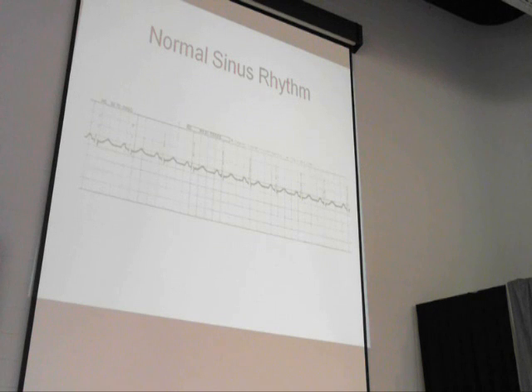Okay. And on the back of your first page, we have every rhythm that we look at, either normal or abnormal when we get into ACLS. We have to give it a name. We have to give it a label. And when we're standing at the desk looking at the cardiac monitor, or standing beside the patient's bed in the unit, or looking at a printout of the practitioner's ordered EKG, we're looking at a hard copy of that EKG.